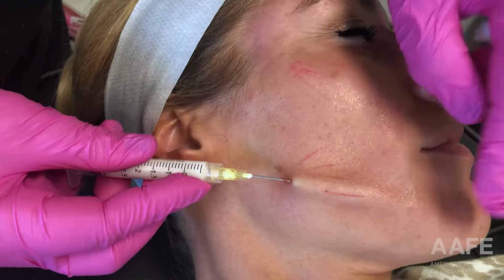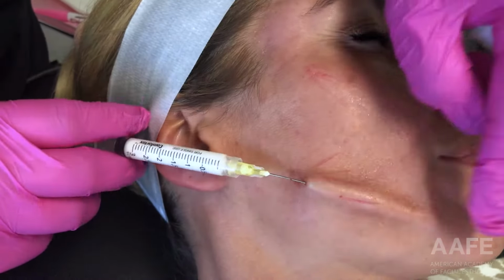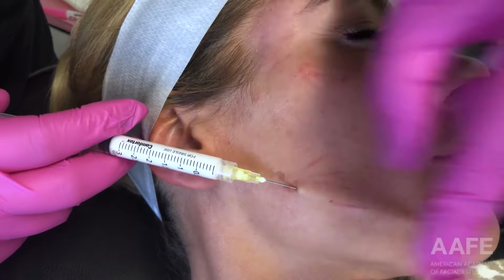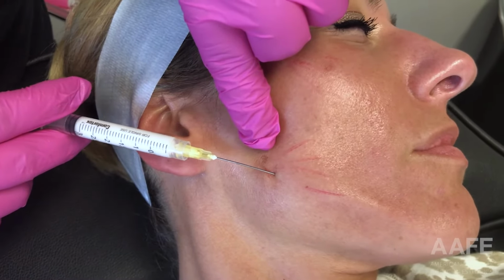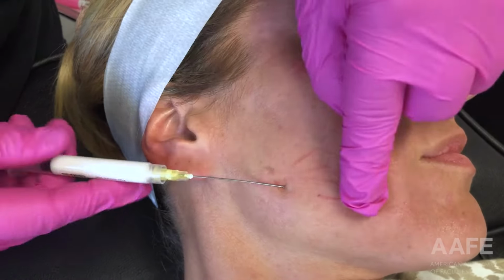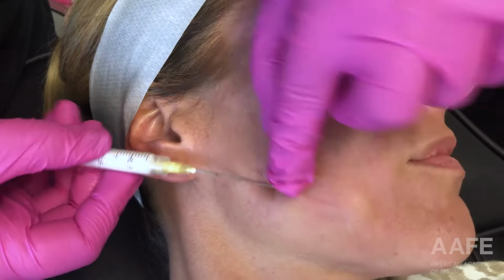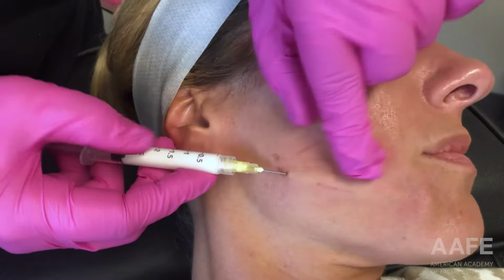So in total, I had 3 cc's of saline to 2 syringes of Radiesse, because Radiesse is 1.5 cc's in total. And we have blended it together nicely, just as it is recommended, and we will teach you to do that once you come to a biostimulatory course with the AAFE. And now we are just fanning the material.